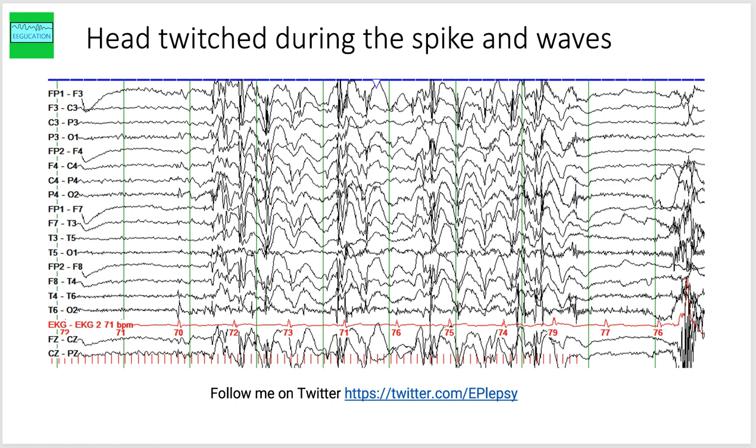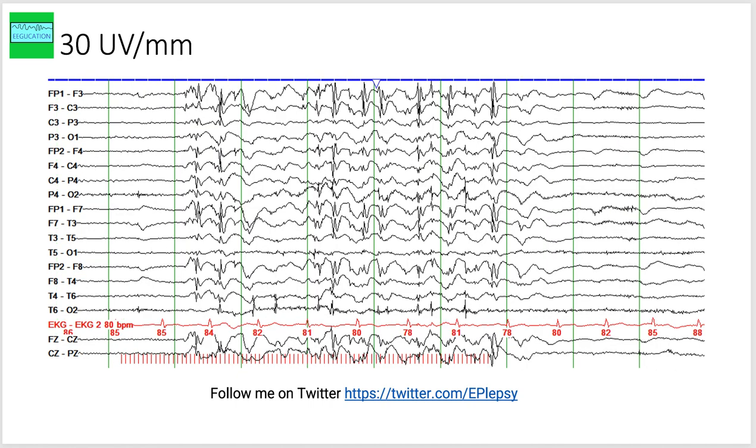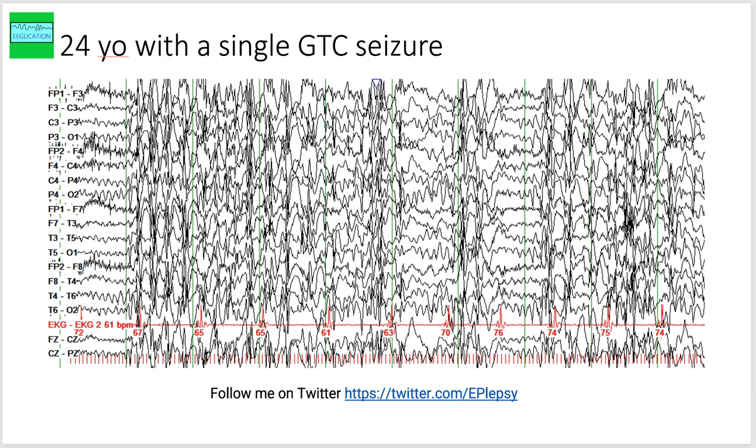Let's look at the next page here. So this is the previous EEG at a lower magnification—not lower magnification, but at a lower gain. This is another person, with a 24-year-old with a single generalized tonic-clonic seizure and a very profound photoparoxysmal response on the EEG.